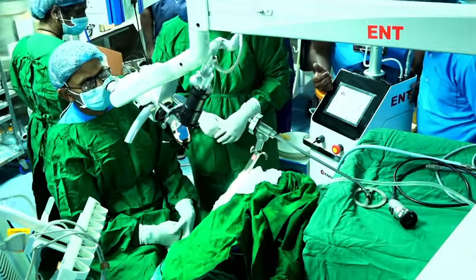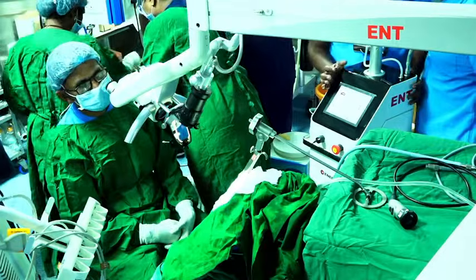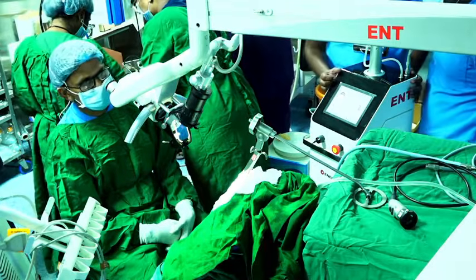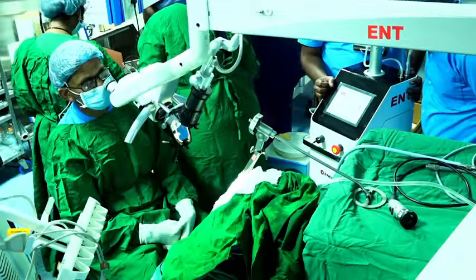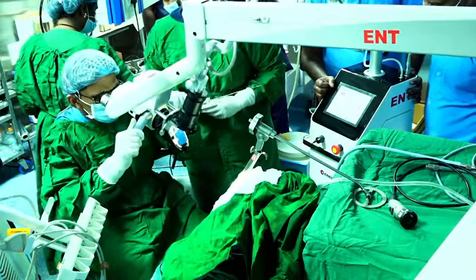Sir, is there any role of laser in Reinke's edema? Definitely. You can use it for making an incision, especially on the superior surface of the vocal fold, yes. But for removal, you have to use suction and remove the exudative material from the submucosal area.